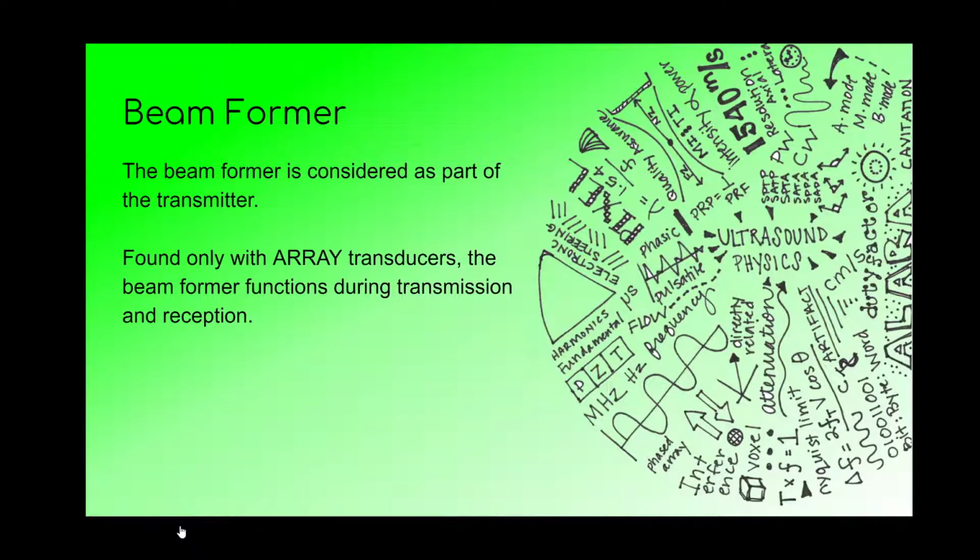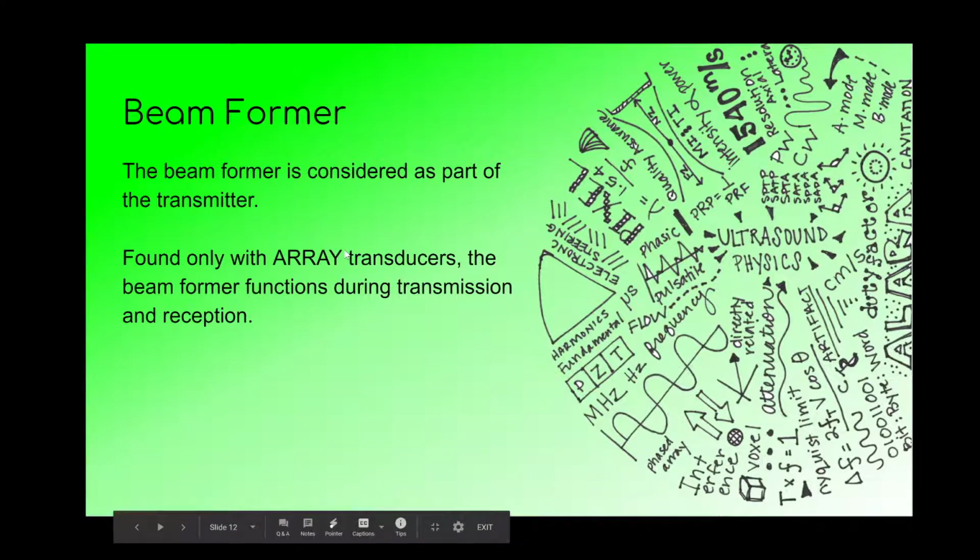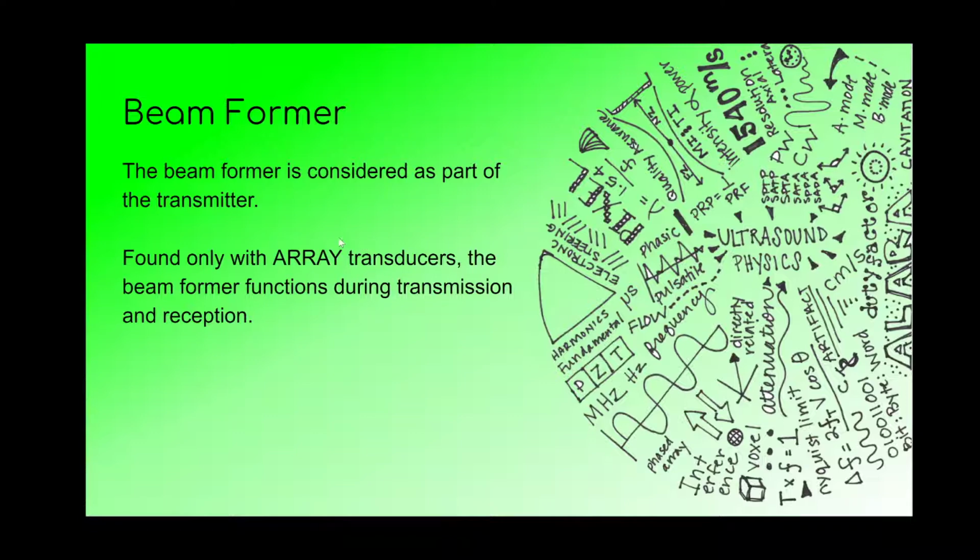After the pulse or the voltage leaves the pulsar, it's going to head to the beamformer next. A beamformer, again, is only found with our array transducers. Remember, array transducers are multiple crystal transducers. So if you need that beam split up a certain way to either steer it or to focus it, then you need a beamformer. The beamformer is going to take the pulse from the pulsar and divide it into those channels, telling those crystals how to utilize the pulse from the pulsar. Again, beamformer only found with array transducers. You have to have a beamformer if you are using an array transducer.